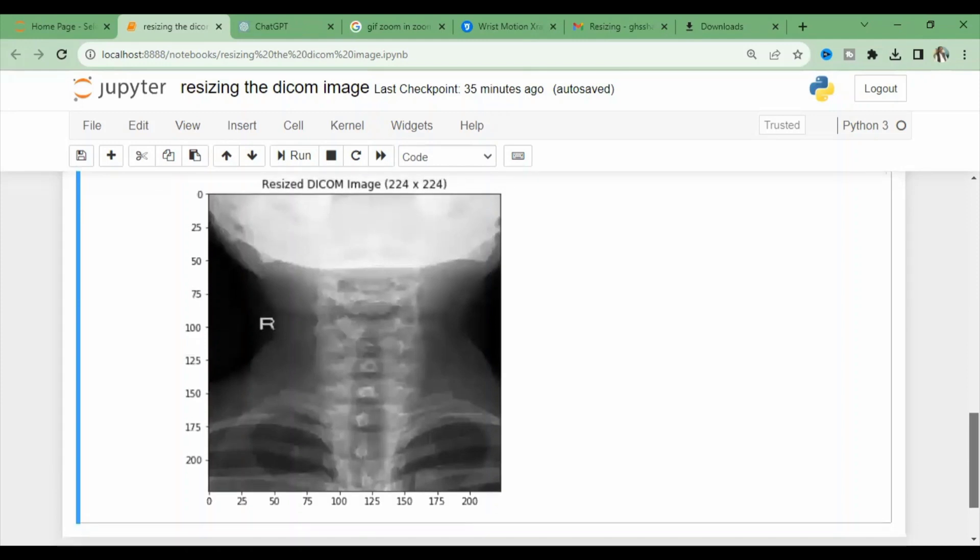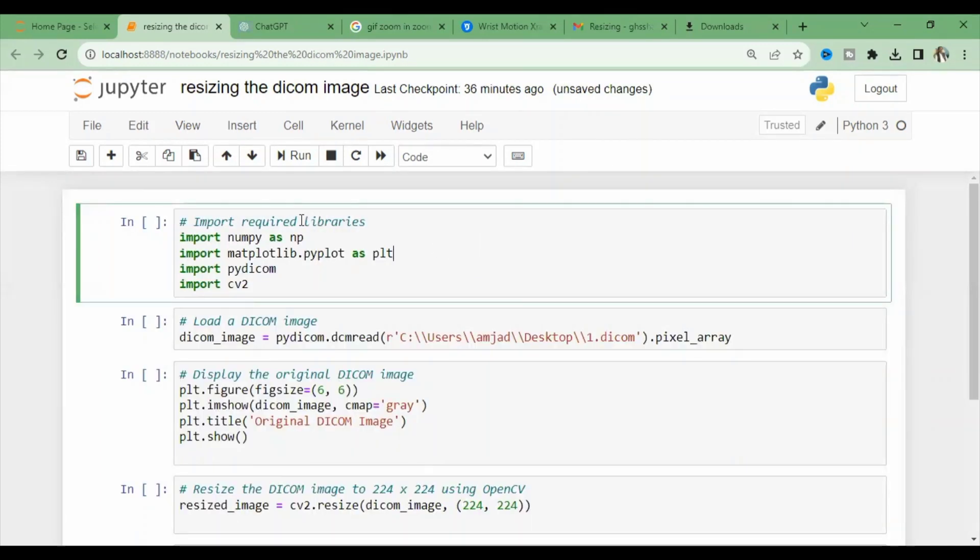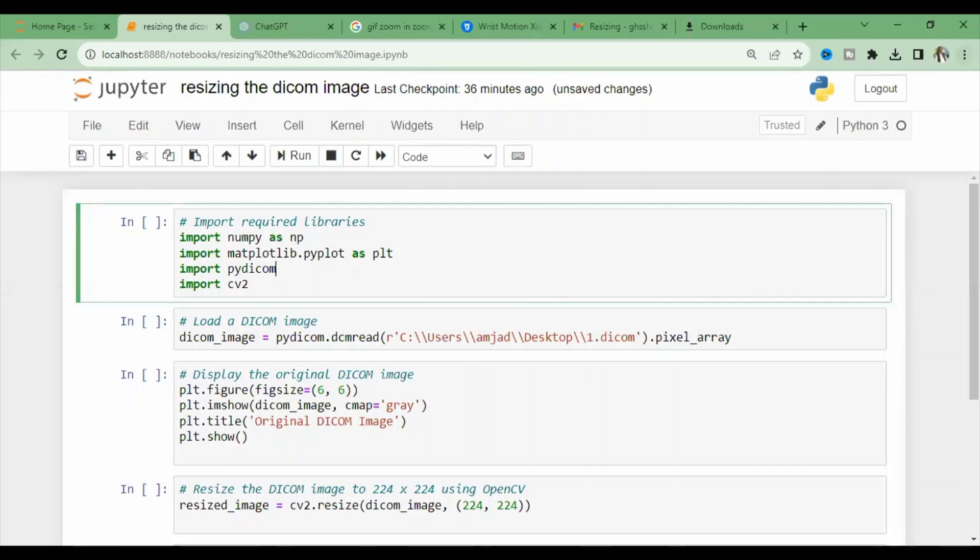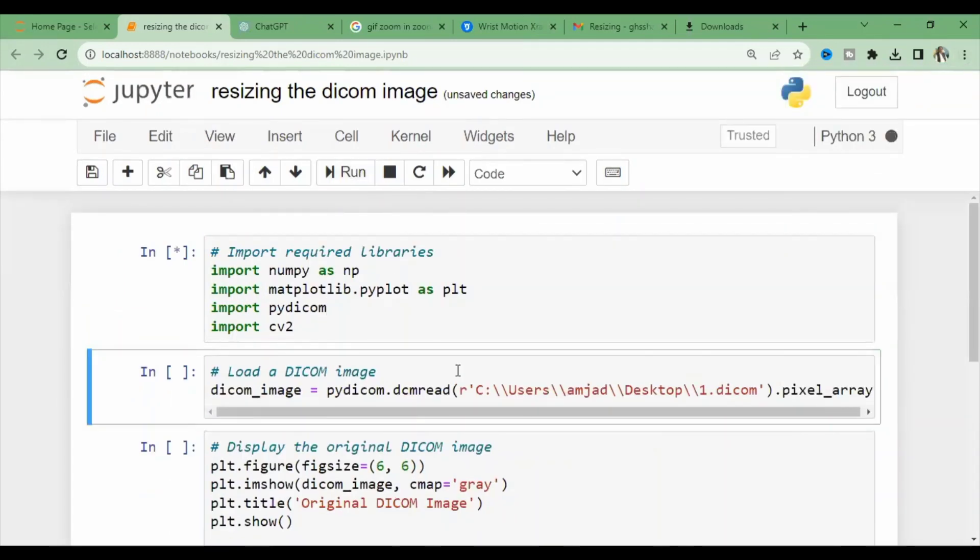Today we are going to cover resizing. As we know, resizing is about rescaling. We can import the libraries that are necessary, which we have discussed in previous lectures, line by line. The second step is loading and displaying the original image, which we already discussed previously.